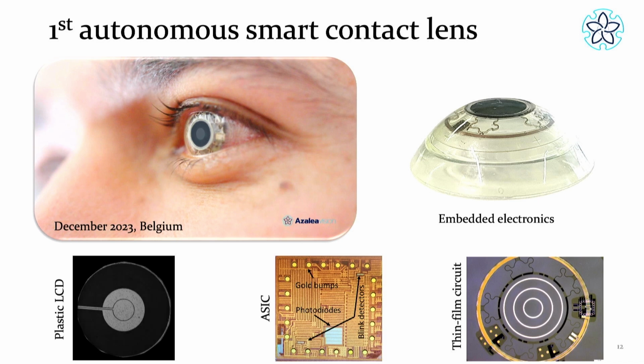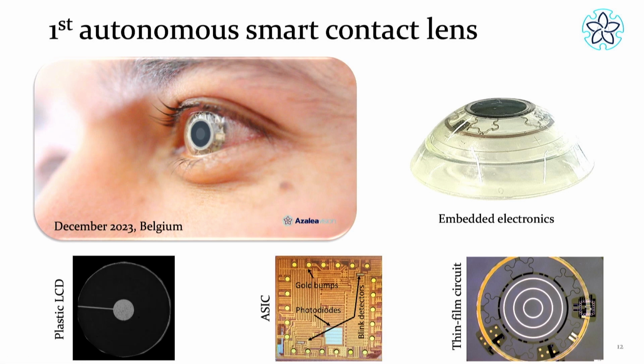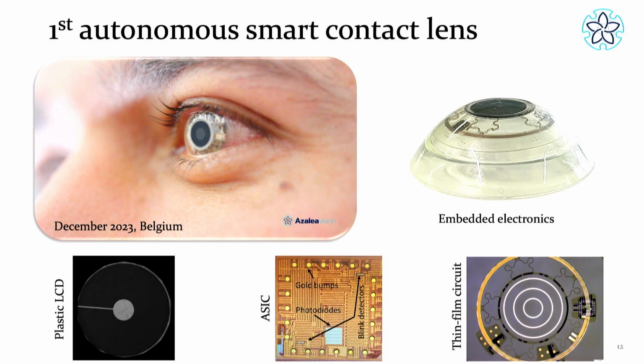And inside we have these three main components that you see in the bottom. So on the left, of course, you have the liquid crystal that can turn on and off. We can change the effective size of the pupil, as you can see in this animation here on the left. The center is a picture of the microchip. So this is a very, very little chip, just 1 by 1 millimeter. So everything is very small. And this is what controls the complete system. And on the right is just the connections, the circuitry, everything made in gold, which is biocompatible, in order to connect all the different components.